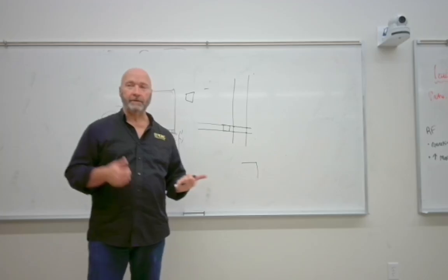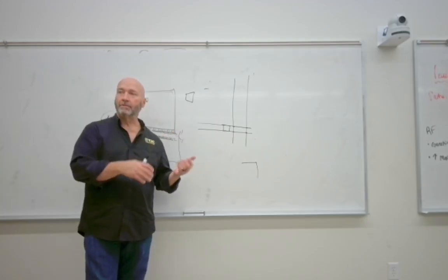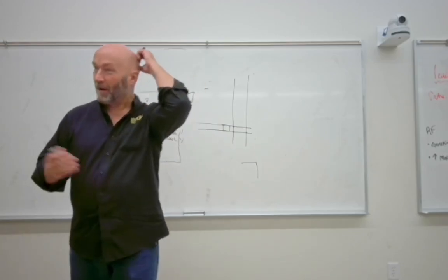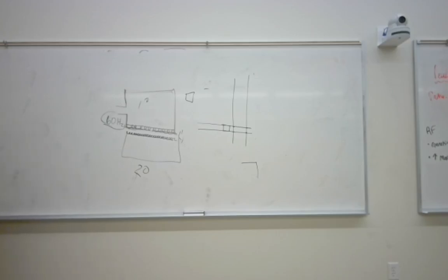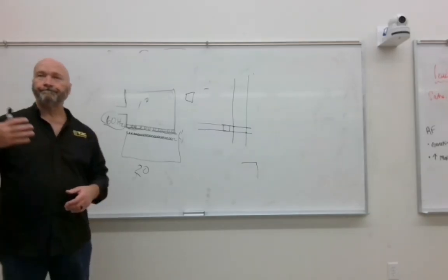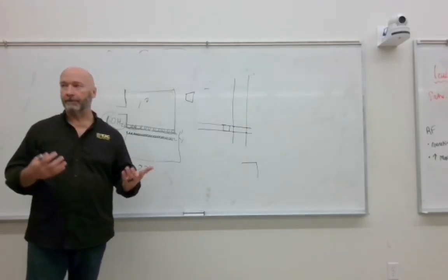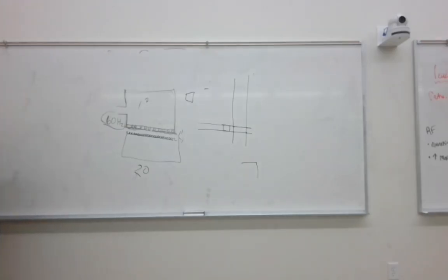Upper GI, from fingers and hands all the way up to upper GIs, lumbar punctures, things like that. So you should be familiar with those last two, just your radiography rooms and your RF rooms, right? Mammography, if you rotate through mammography in your second year, then you'll see those rooms as well. So in that context, we can refer to them by the energy they create: high kVp, fluoroscopy, diagnostic, or we can refer to them as the function that they put out, be it a radiography room or a general RF room.